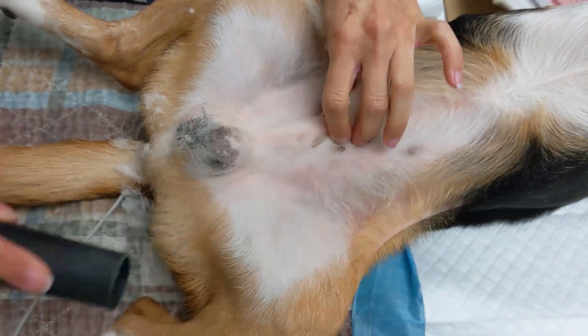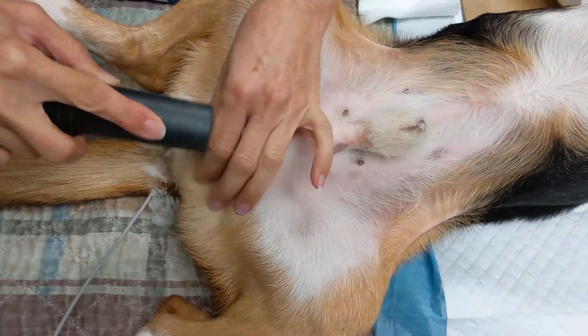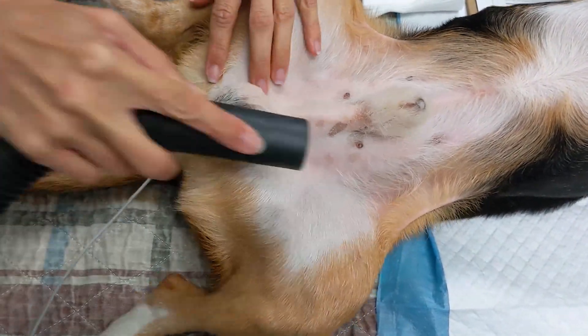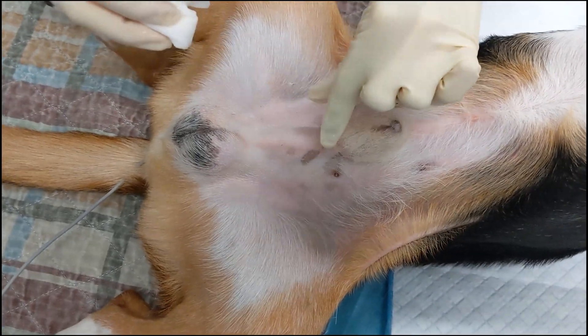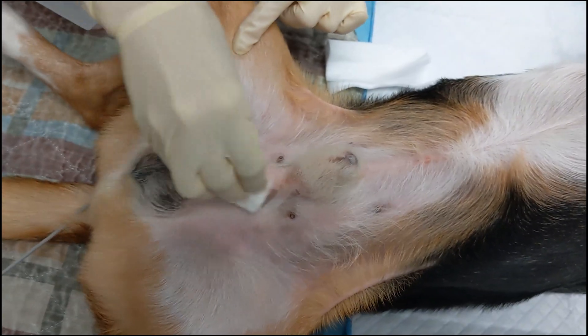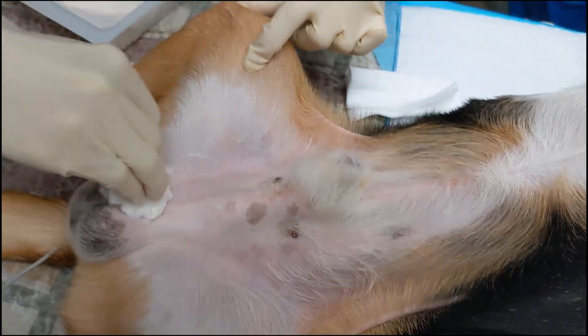The clipped fur is then carefully vacuumed off the patient and the table to help decrease the risk of contamination. In the induction area, an initial dirty prep is performed. The purpose of this prep is to scrub away dirt and debris and to start contact time with the chlorhexidine scrub.